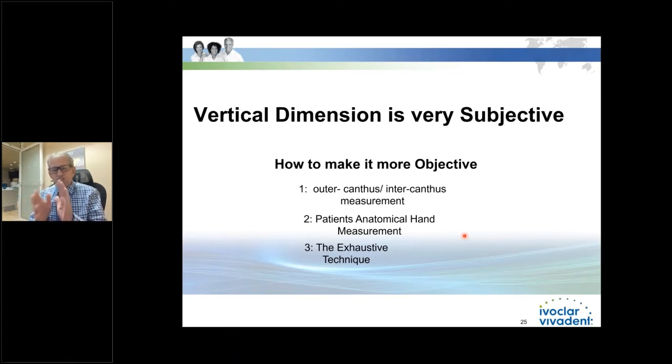So you practice that just once with them, and then you go to real life and you say M, M, M, M, and stop them, measure very quickly. So you tell the patient that all I just want you to do is when I tell you to stop, just stop. Don't close, don't protrude, don't go left, don't go right. Just close and wait a quick second, and then you take that quick measurement.